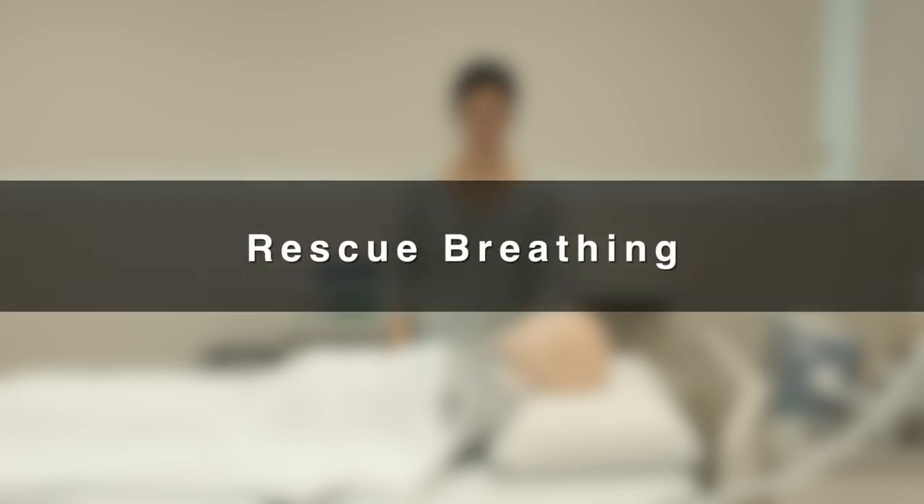Rescue breathing is a technique to assist a patient who is not breathing. We will demonstrate rescue breathing using an Ambu Bag.